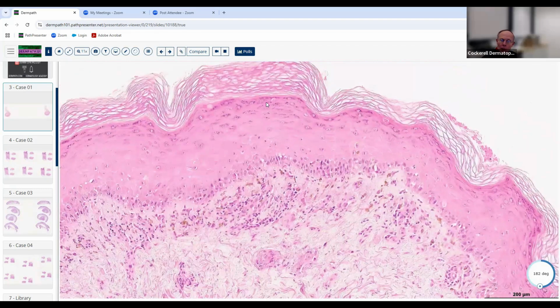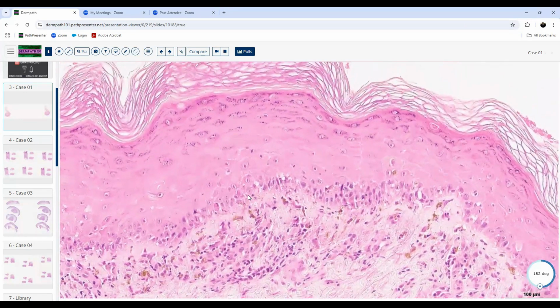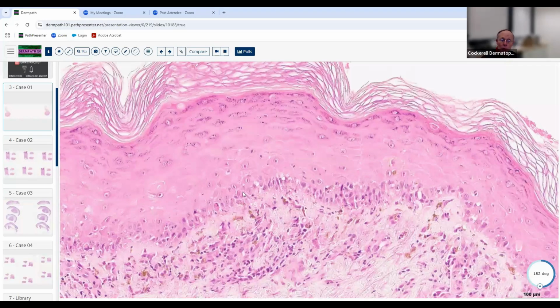And then what about this epidermis here? Let's see. Like in lupus, if you see somebody that's got subacute lupus erythematosus or maybe relatively long-standing systemic lupus erythematosus with skin lesions, when you do a biopsy of their skin, what do you usually see? You see this change for sure, but do you see this type of change up here?